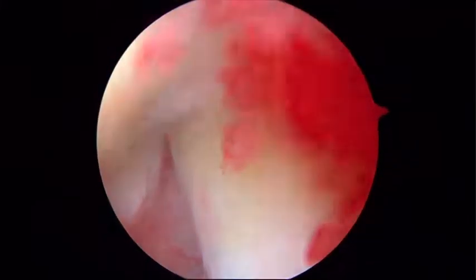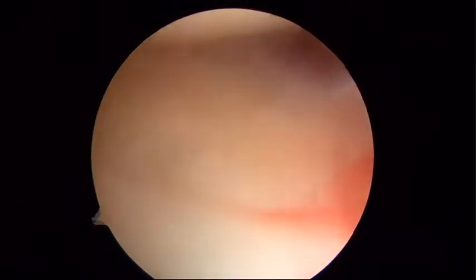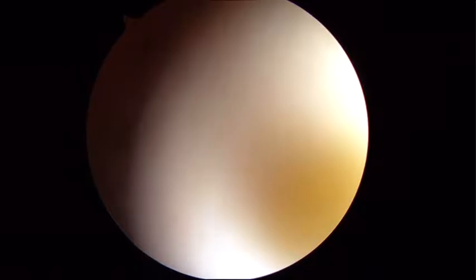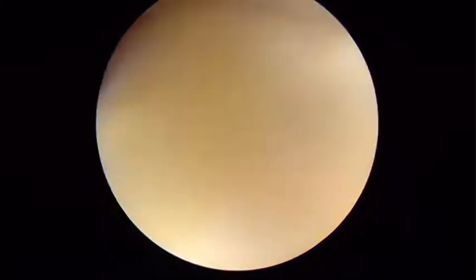This is a left shoulder. Patient's in the lateral position. Looking up, you can see it's quite inflamed, possibly has a component of capsulitis, a little bit of chondromalacia on the head and the glenoid. And then as we look inferiorly, we'll see the infraspinatus has a bit of an undersurface tear.